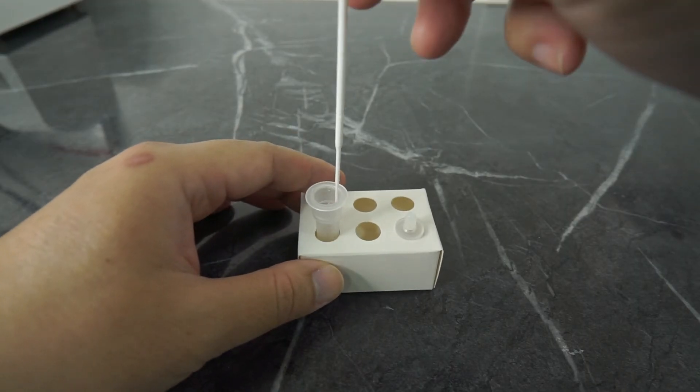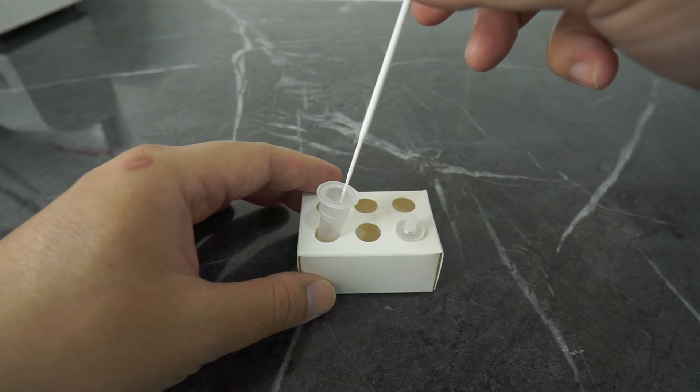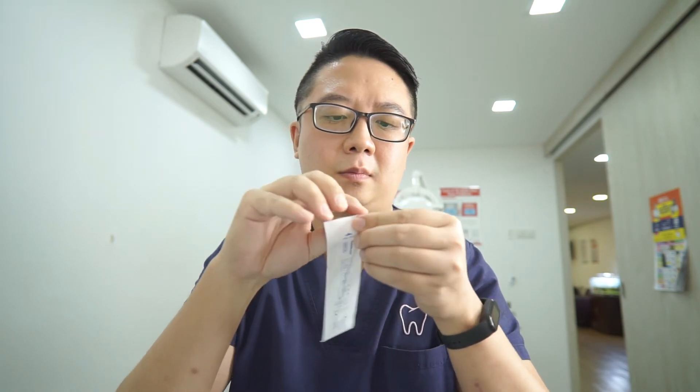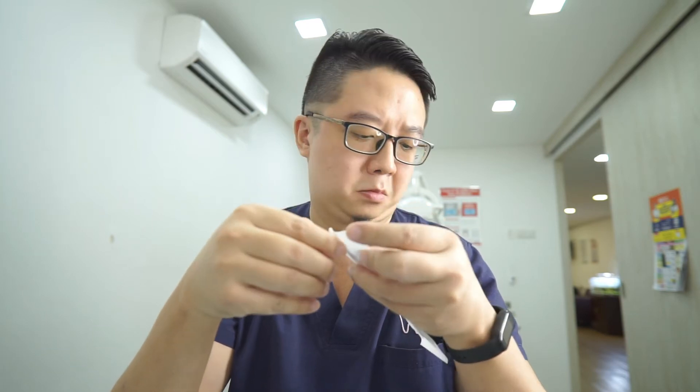Put swab one into the extraction tube containing the buffer liquid. Then we move on to swab number two. Remove another disposable swab from the sterile packaging. Remember to avoid touching any surface or object and do not touch the fabric tip of the swab.